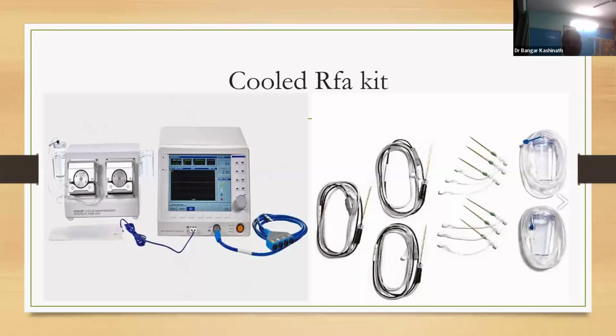Okay, what is this? Have you seen this? Cooled RF. Okay, whenever in an examination, try to make a habit of saying the full forms of everything. Cooled radio frequency ablation kit. Okay, so this is a cooled radio frequency ablation kit with the generator, right? RF generator, right? What are the indications?